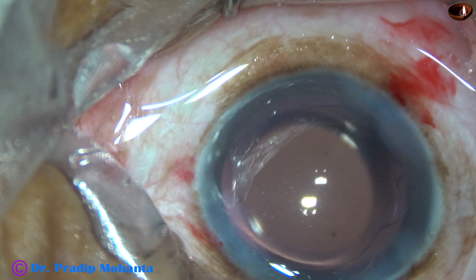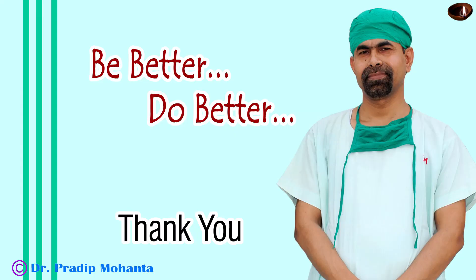The intraocular pressure should be on the higher side of normal. The integrity of the wounds is checked and the case is concluded. Underwater phaco is not difficult — just take the challenge and do it. Thank you very much for your eagerness to learn.